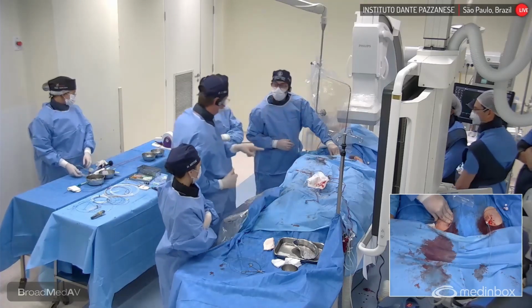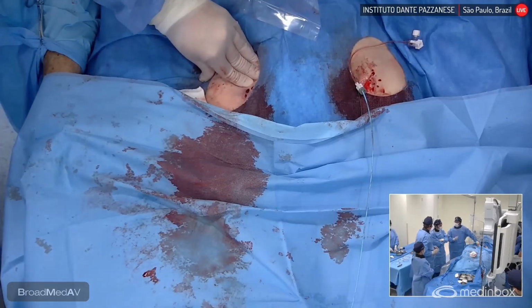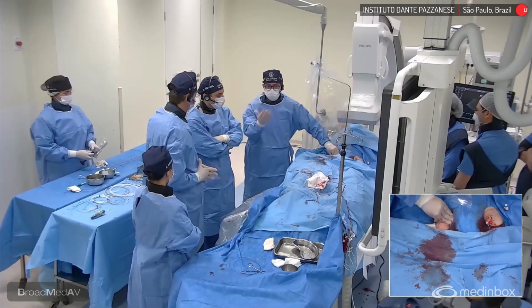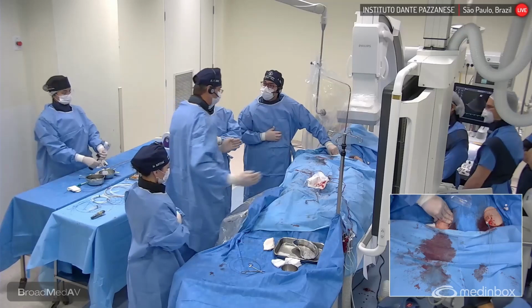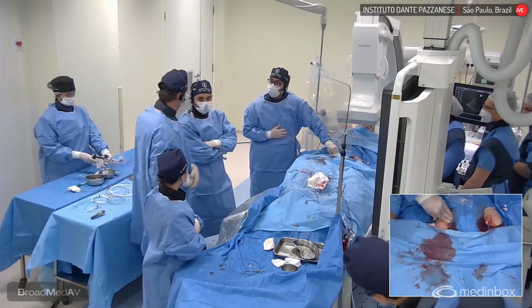So if you have a complication, what do you do with this? We go with a balloon, like a 5 by 40 balloon. We inflate the balloon until we decide if we need a covered stent or surgery. So if you go with a covered stent, you do it from the contralateral? Yeah, we go to the contralateral.